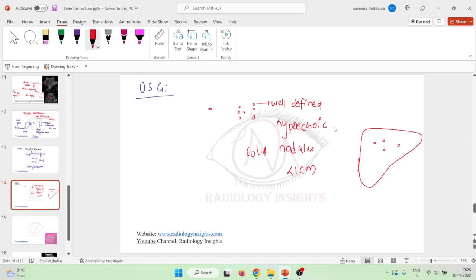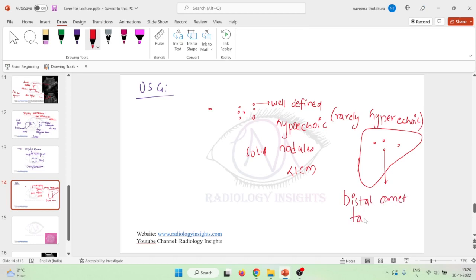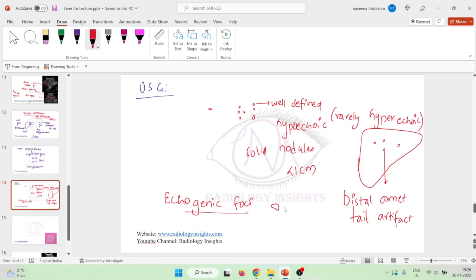These can be hypoechoic or rarely also hyperechoic. They can have bright echogenic foci seen along with a distal comet tail artifact in the liver. Sometimes echogenic foci are also seen.